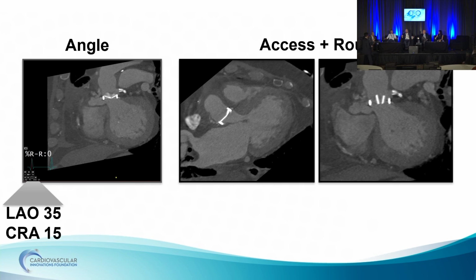Yeah, it does. Most Oscors come in a wider range of working lengths, which is a nice feature of the Oscor, except that you then need subsequently longer catheters to fit through them. Whereas the Direx and the Agilis are both like a 72 working length, and you can get an Oscor up to 90, but then it's 105 to the handle. So it's just stuff you have to mix and match. Totally. All right, Direx.